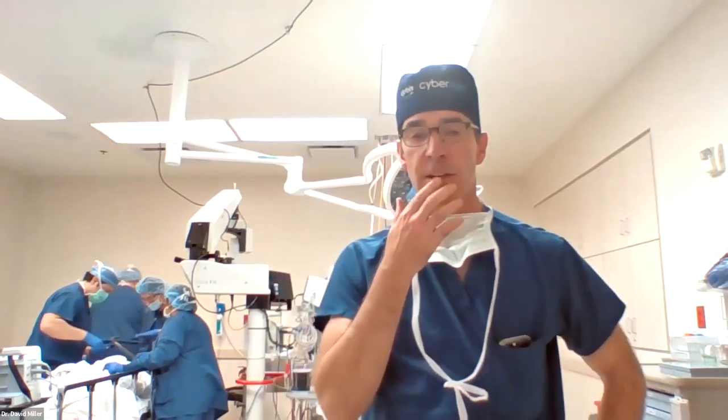If a vitrectomy machine is not available, can I do secondary IOL implantation without vitrectomy? You certainly can. If you don't have access to a vitrectomy and the lens implant is somewhere in the iris plane area, I think you can very cautiously manipulate it so you could grab that lens implant and do a scissor vitrectomy as you're explanting it, to try and keep the vitreous from trailing you out of the eye. Certainly your risk is higher for retinal tearing and detachment, but you can do that.